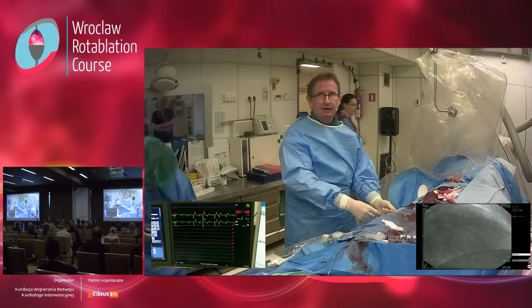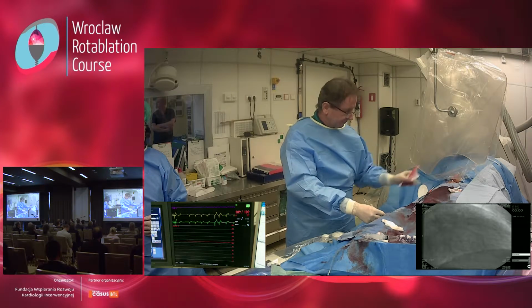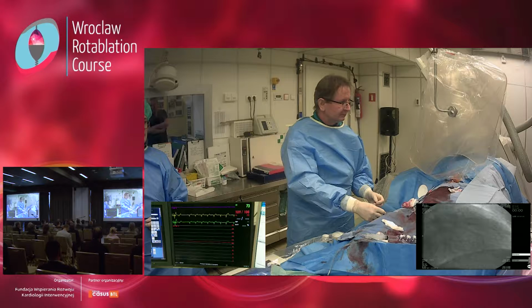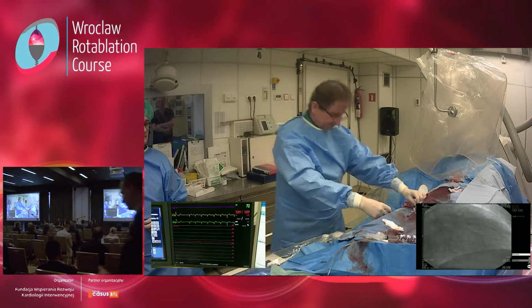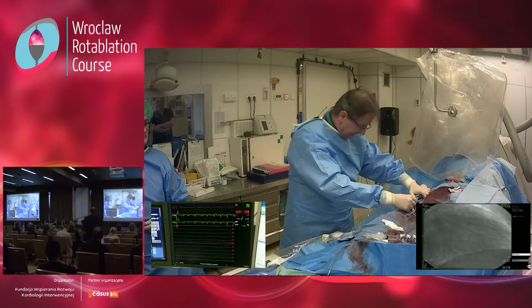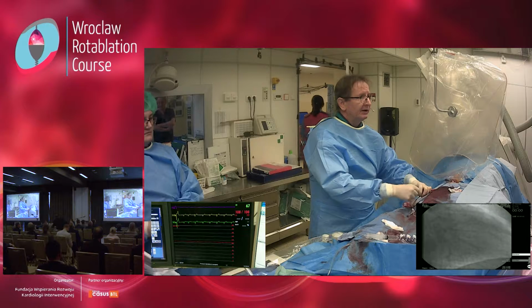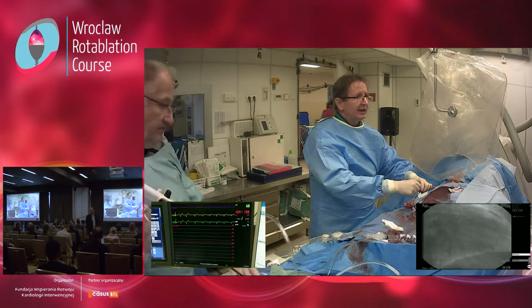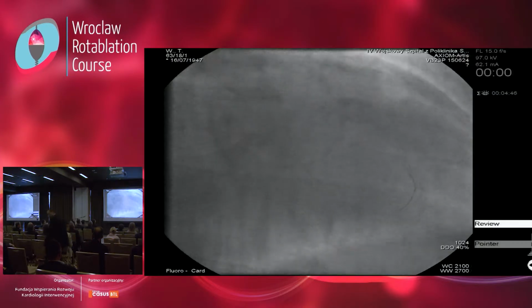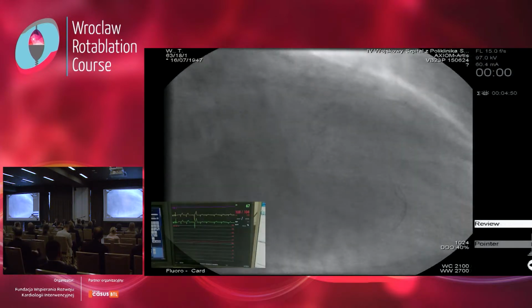So we use 165. Okay, perfect. Yeah, so fine. And we go now without dyna, as long as it is easy going. And then maybe the last part, then we use dyna.